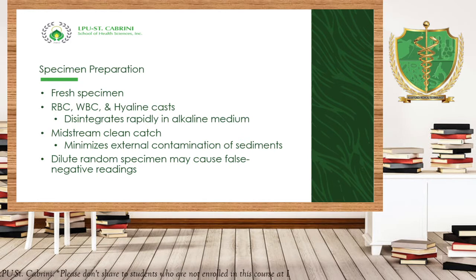Or, urine samples can be refrigerated for at least 6 hours without gross interference in the urine structure or urine sediment. However, if we are going to preserve or let our specimen stand in room temperature, there will be a change. As we all know, there will be a change in the parameters that will be tested in the urine.